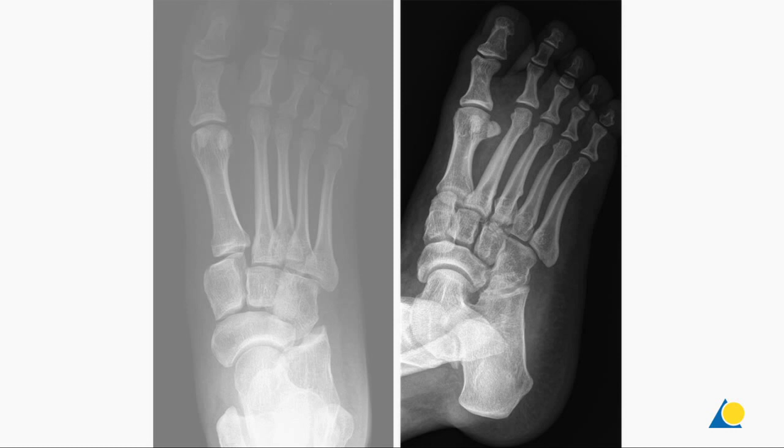In the event of a high-energy injury, the lateral profile might also be displaced with the MTs elevated.